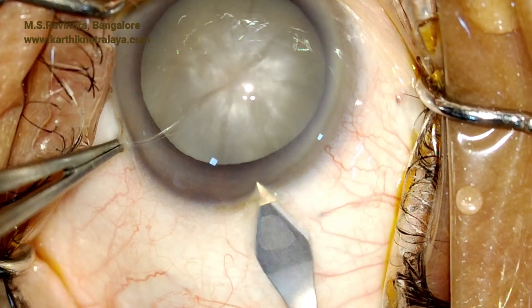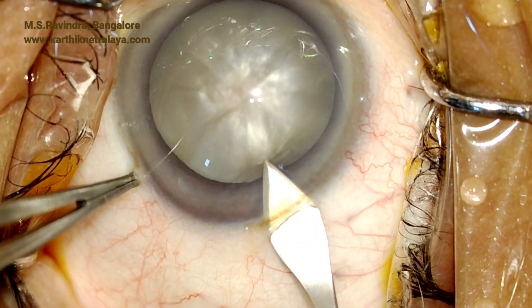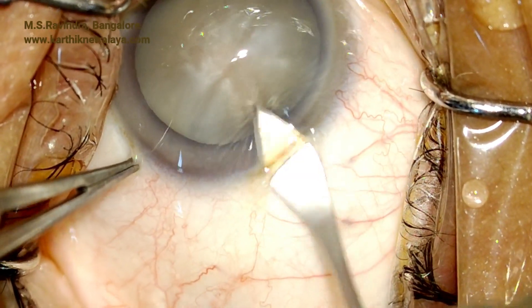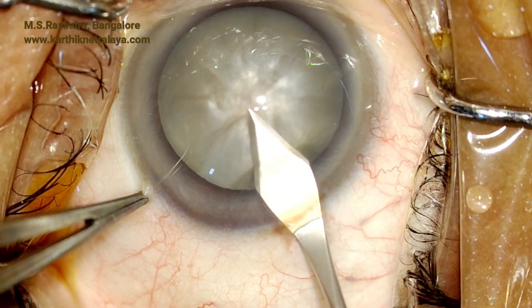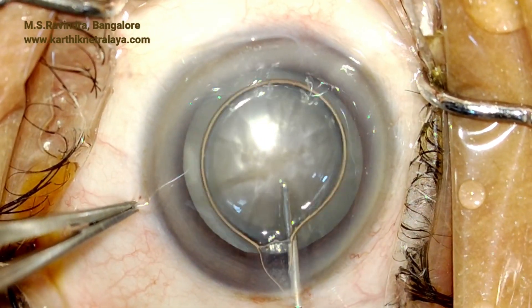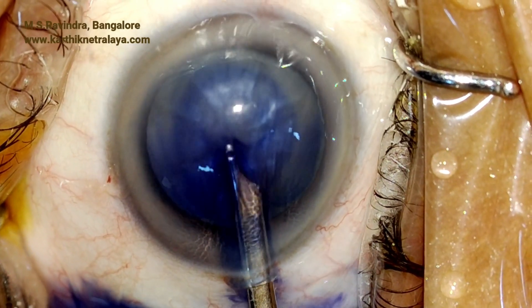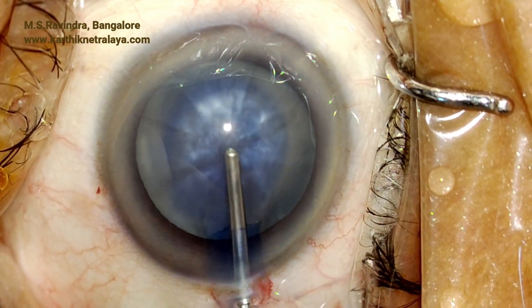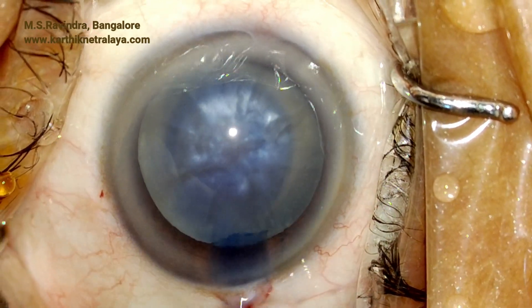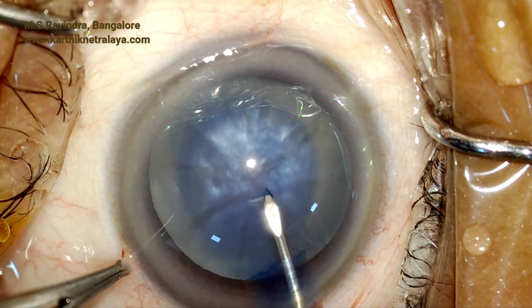A hypermature senile cataract with a very tense capsular bag. A 2.8 millimeter keratome enters from the anterior sclera. You can see a scroll of the tunnel traversing across the limbus and entering the chamber in the peripheral cornea. Staining is done under air; visco fills the eye. HPMC is the viscoelastic I prefer because it coats the endothelium quite well.